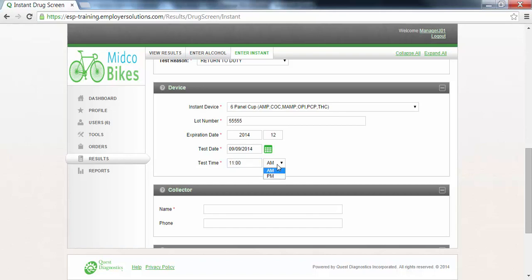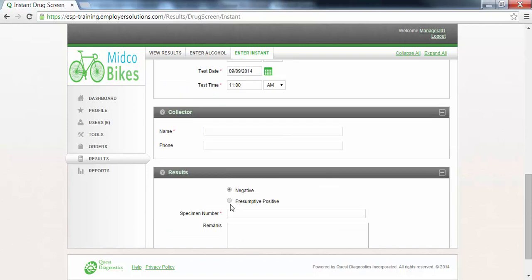The collector section is where you will enter the name and phone number of the person who performed the instant test. The name field is required as indicated by the red asterisk. In this example we will enter Susan Jones.